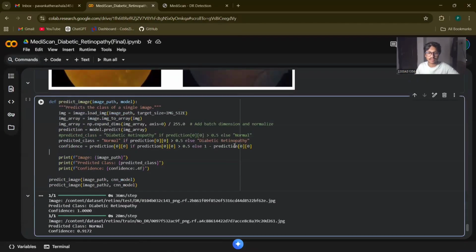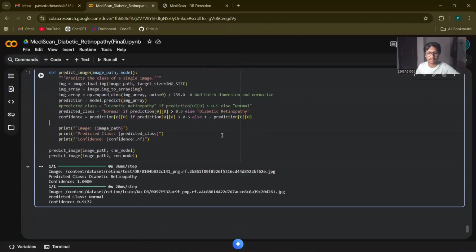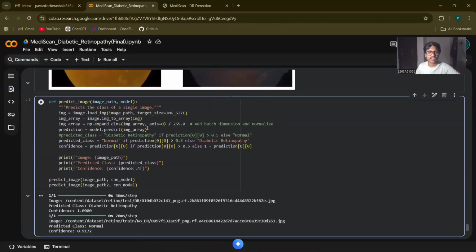And coming to the next section, this section outlines the final and most crucial step: using the trained convolutional neural network, the CNN, to make a diagnostic prediction on the retinal images. So here, first we take the model prediction and the confidence. This function takes two inputs, the image path and the model, the pre-trained CNN. And here the image is first loaded and resized to the exact dimensions we gave as the target size here.